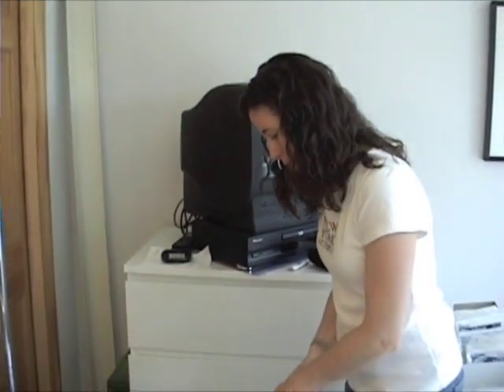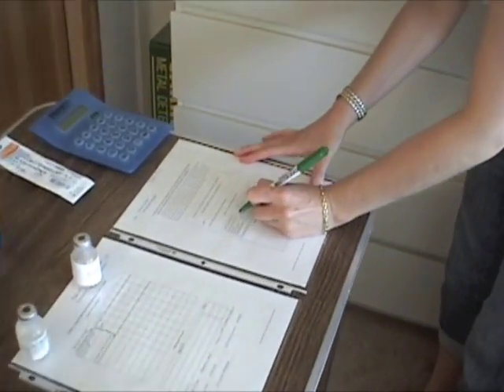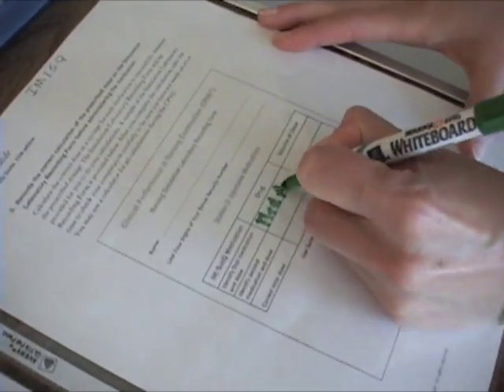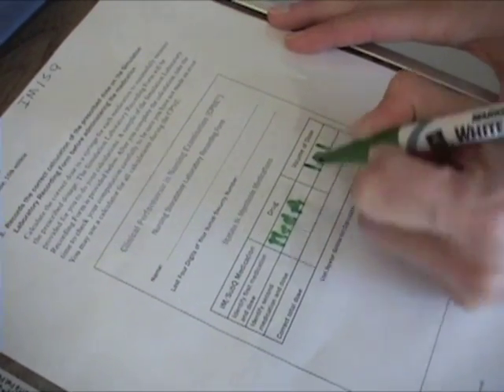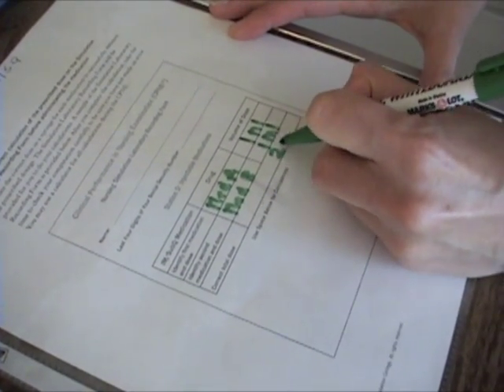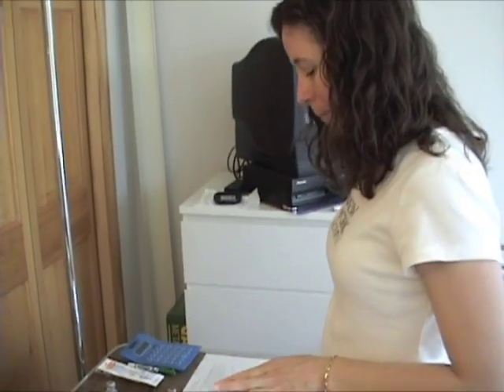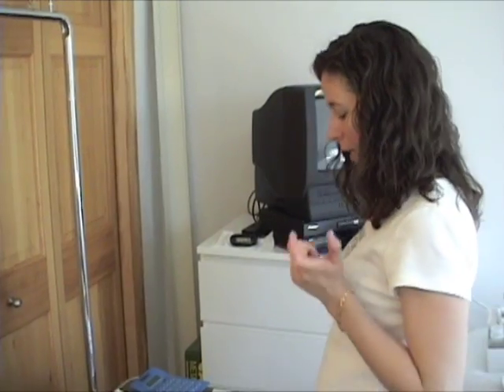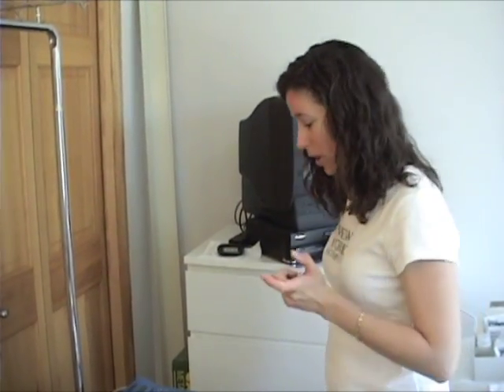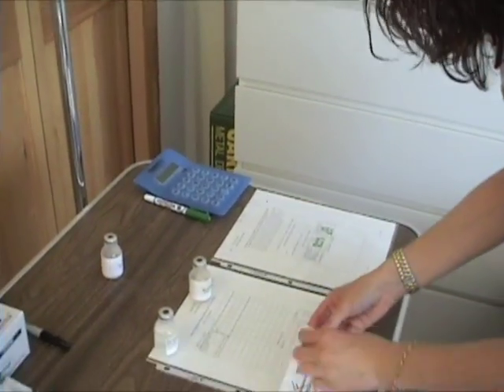So I'm going to come to this form here, and where it says drug, I'm going to put med A. I need to give 1 milliliter, and med B 1 milliliter for correct total dose of 2 milliliters. Okay, so these I'm going to give ventrogluteal injection, so I need a needle that's 1.5 inches long. So among all the needles, I'll select that one. Let's say it's this one.